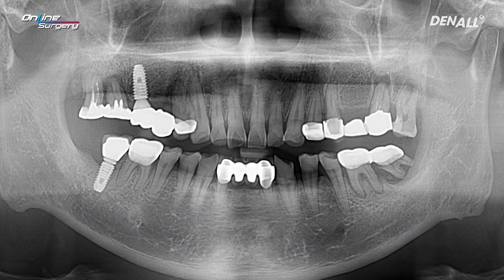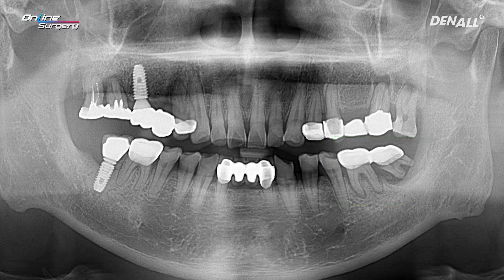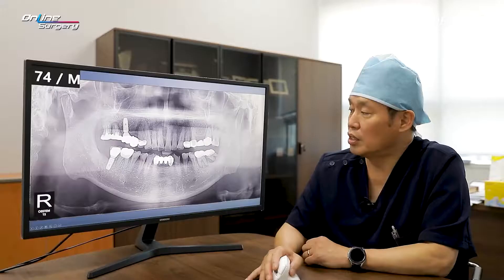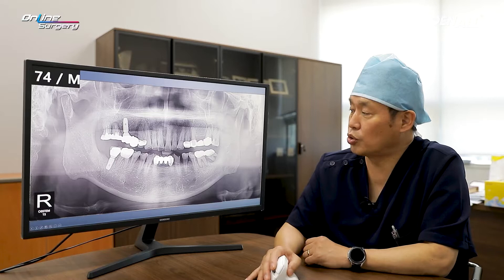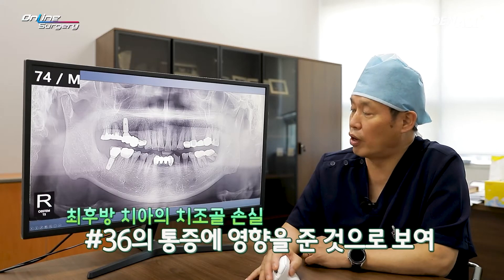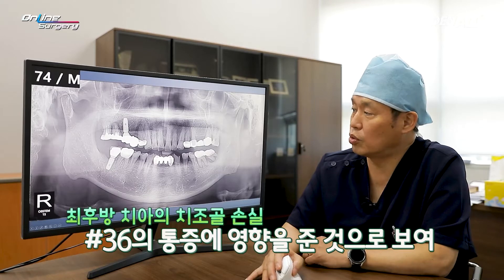I took a panoramic image. Number 36 and the tooth behind it are connected in a bridge — I think number 37 was missing and number 38 was mesially tilted and connected using a bridge. The two teeth are connected as shown. However, complete alveolar bone destruction occurred distally at number 36, and there was mobility and the patient complained of pain.